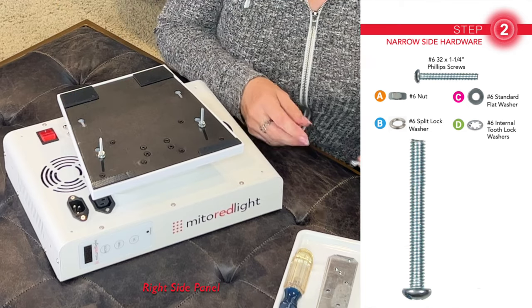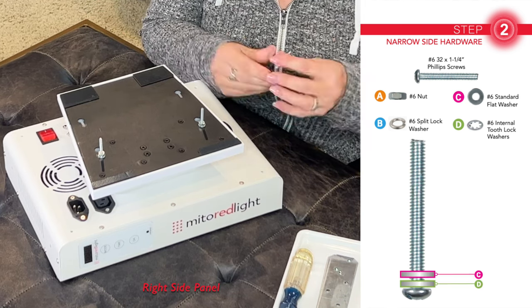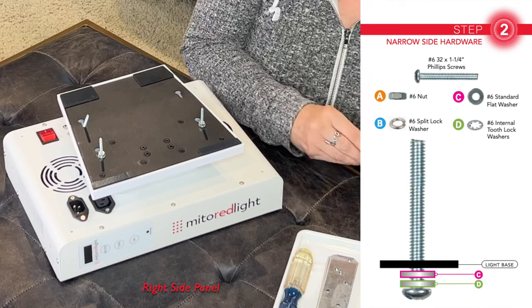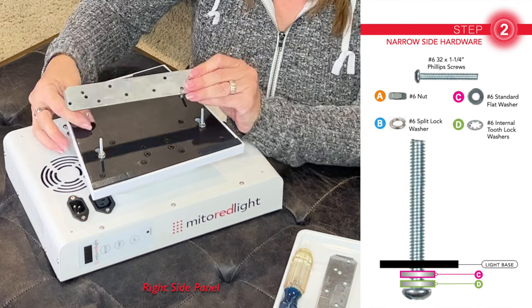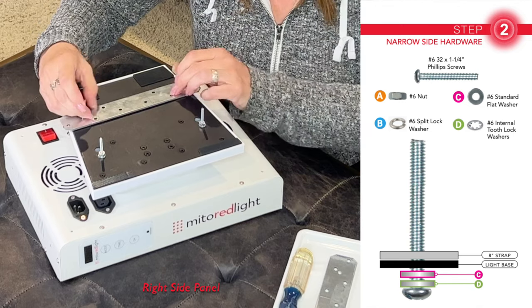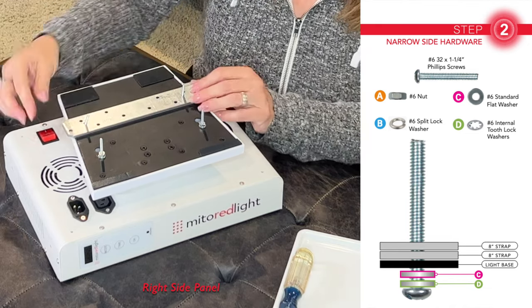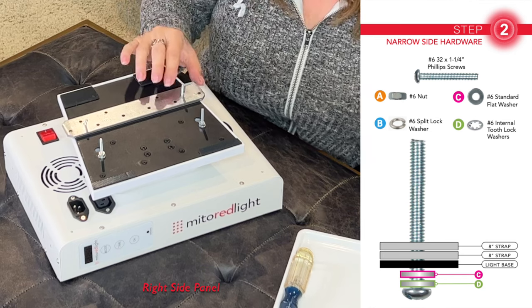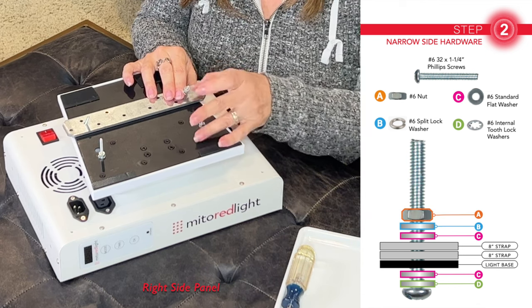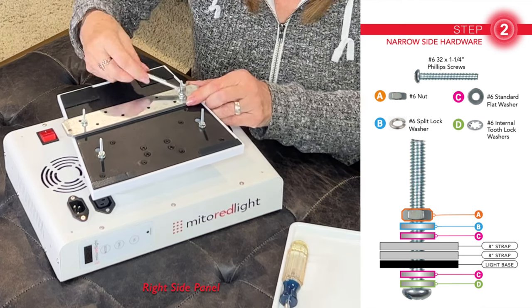Now on the narrow end of the base — and again, these two will be identical — on a number six screw, put a tooth washer and a flat washer, slide that into the holes, and push it all the way forward. It'll have to balance there loose while you do the other side. This 8-inch strap is a 12-gauge galvanized steel strong tie. You'll need to drill two holes on each of these 5¾ inches apart so they'll line up with the screws — you're going to need a total of eight of these. Line up the second strap with the first and push them both forward to be sure they're all the way into the end of the slot. Now place a flat washer, a split washer, and then a nut. Do the same on the other side and tighten it down until it's snug.